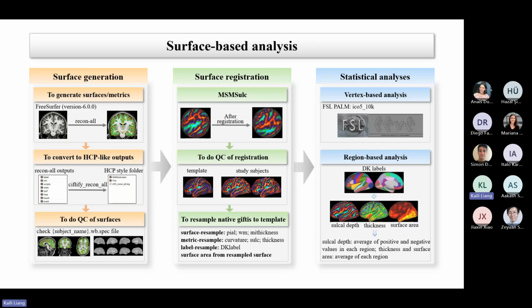unstable, I guess. I see what you mean. Because of the math libraries, any small change gets accumulated through the whole pipeline. If there's some sort of random initialization that gets changed, that results in one or two voxels different in the white matter segmentation, and then that creates a difference in the surface. So there are huge differences in the surfaces generated for the same subjects of the biobank when they're run on different systems.